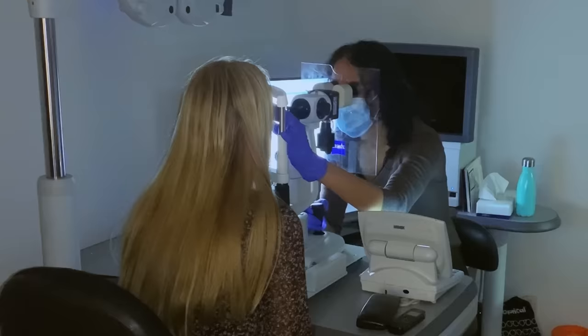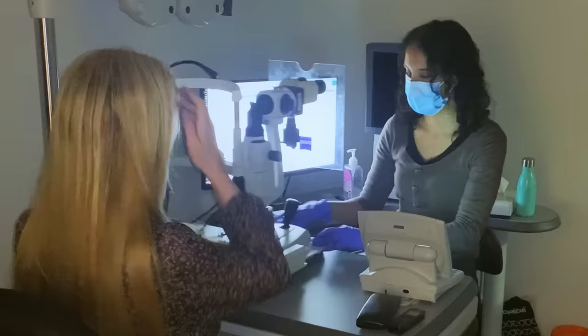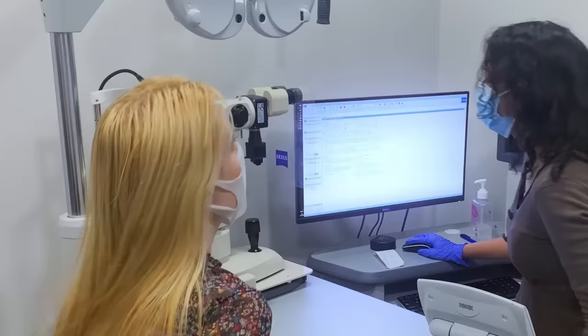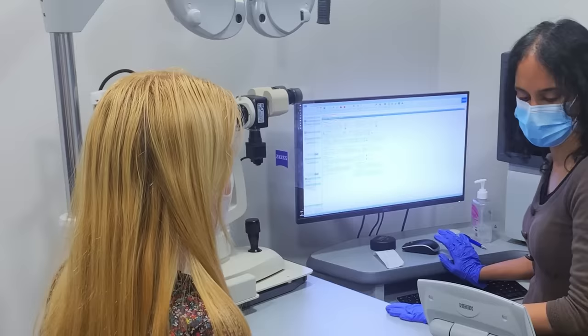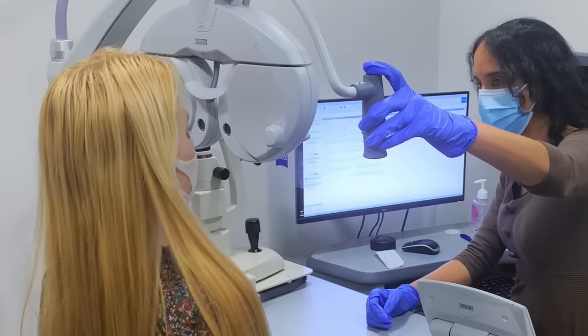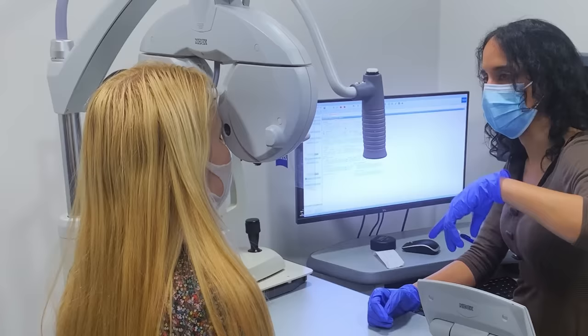Thank you. Brilliant. So I'll just turn the lights back up. Okay, so listen, that all looks absolutely fine. I was checking the more anterior layers of your eyes as well, but no concerns at all. That's good. So now we'll check your glasses prescription. If I can ask you to look through these for me, like a pair of binoculars. You can rest your head on there, brilliant. Is the height okay? Yes. Okay, lovely. So we'll do your right eye first. I've made your left eye a little bit blurry.